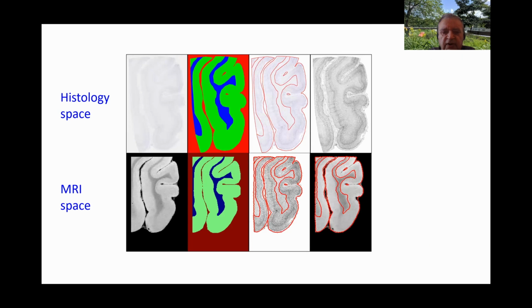So I'll cut it here, and then we use this deep learning method in order to segment the gray matter in one of the tissue slices cut from level 3 block. It's difficult to see here, but that would be myelin on the left. Here is the gray matter, white matter segmentation. We superimpose the red curves on the histology. And this image is the same histology tissue, same section exactly, only in gray levels.